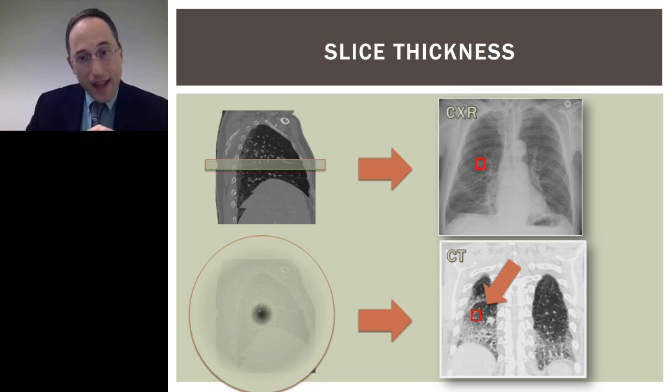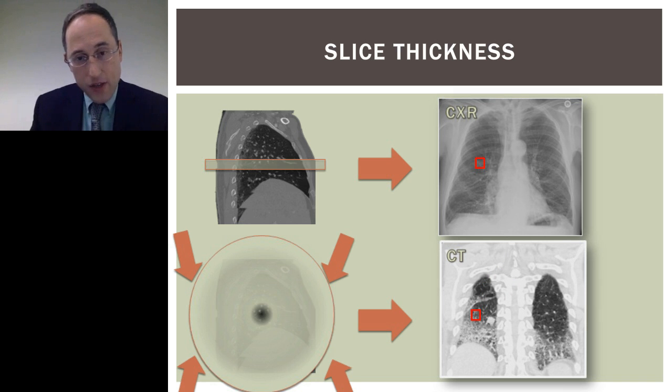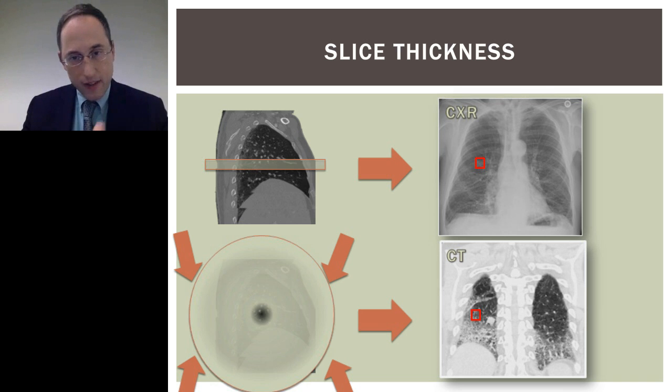For that, it is the intensity of that actual piece of anatomy in the patient plus a very, very slight contribution from all surrounding anatomy. So you see how I drew this circle around the patient and I grade things out. If you took all the values in that circle and summed them together, that would be the value of the pixel on a CT. So that's how the intensity is determined in those two modalities.